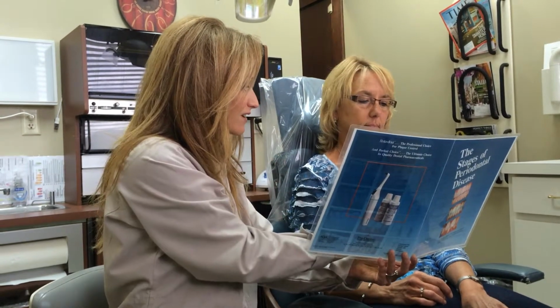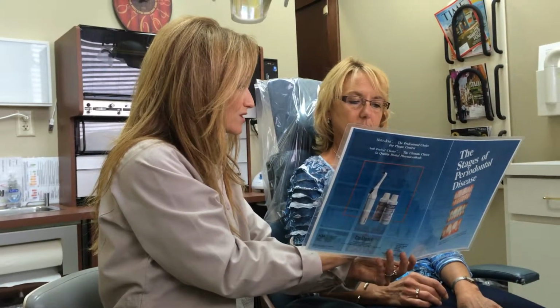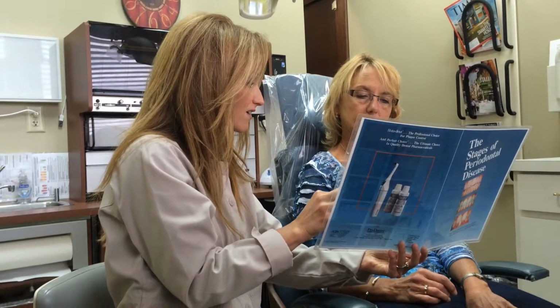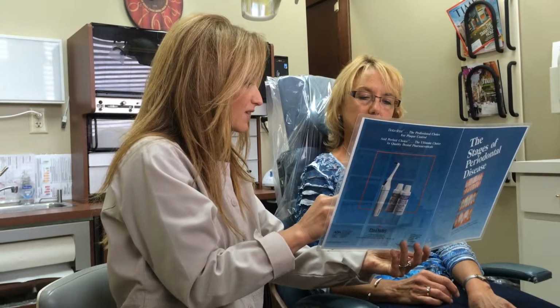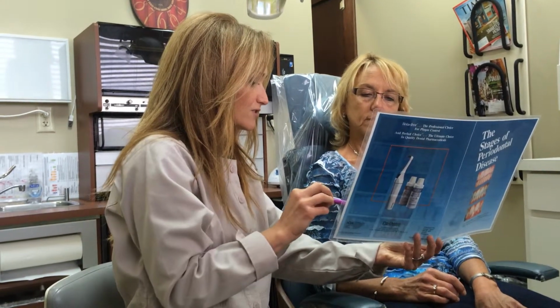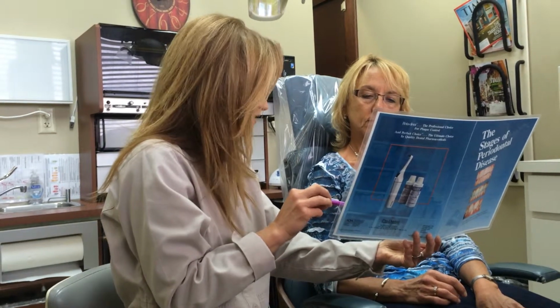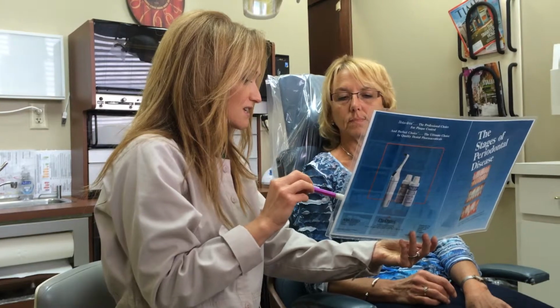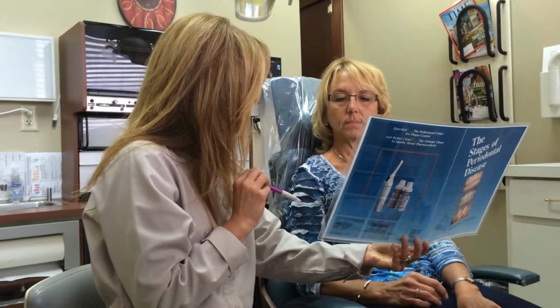In a moderate category, our numbers are deeper, usually between 4 to 6. I say the average is about 5, and that's what you'll see here. Our ruler drops down a significant amount. Lots of infection has eradicated this bone, and if you just touch this tissue here, we'll get lots of bleeding, some swelling. But most importantly, on the X-ray, we can see the bone dropping right around that too.